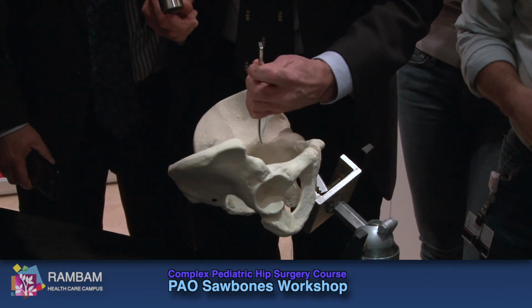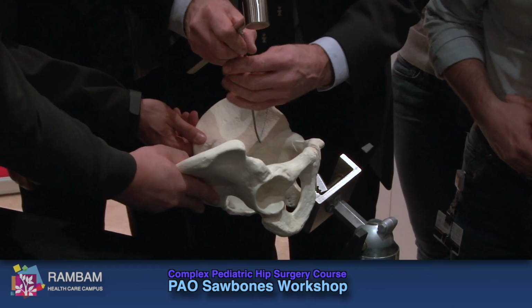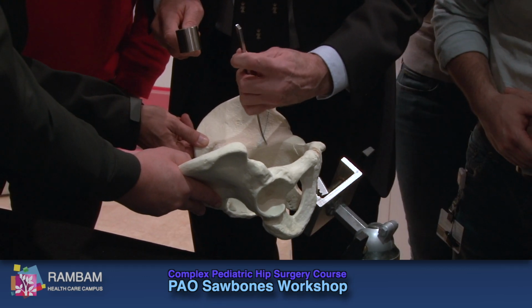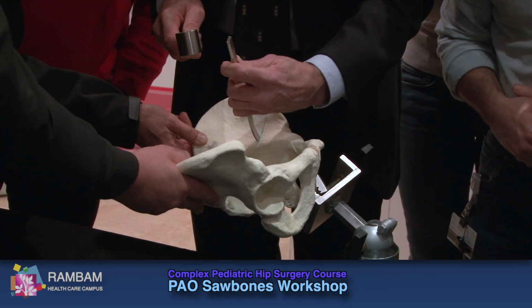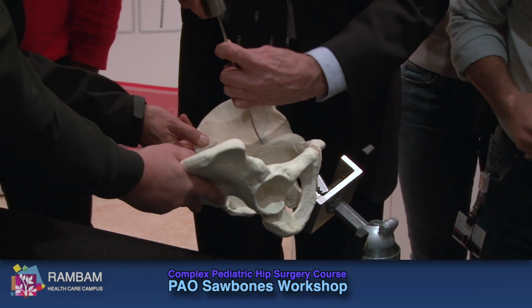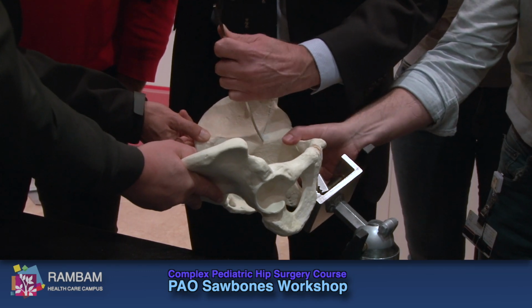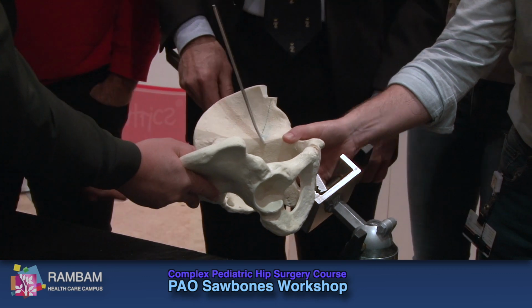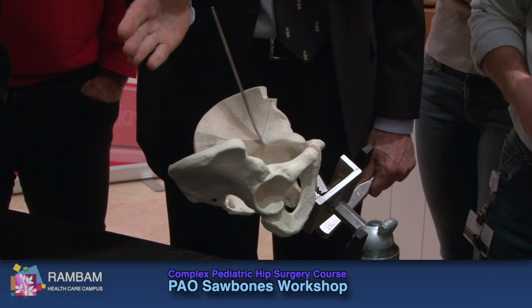I do a 120 degree cut. So I'll start here, and I think, well, that's 180 degrees, that's 90 degrees. So about like that's going to be my cut, about 120 degrees. I'll put my osteotome like that. Then I'm going to take an x-ray, again in that position.